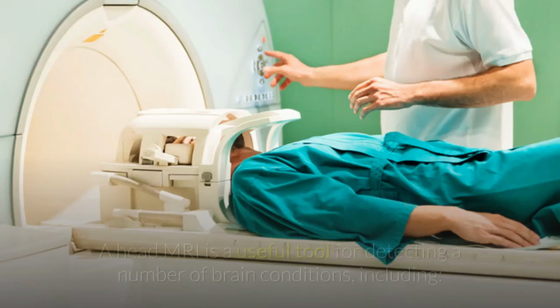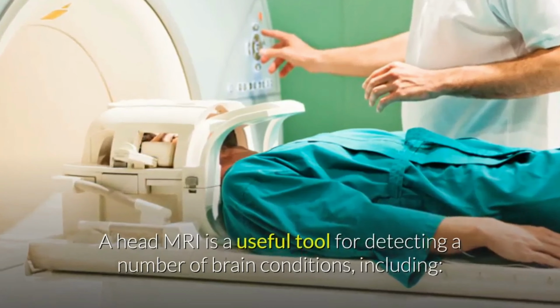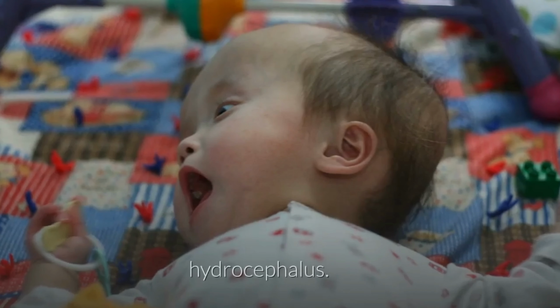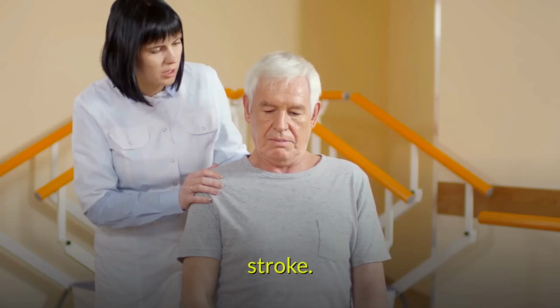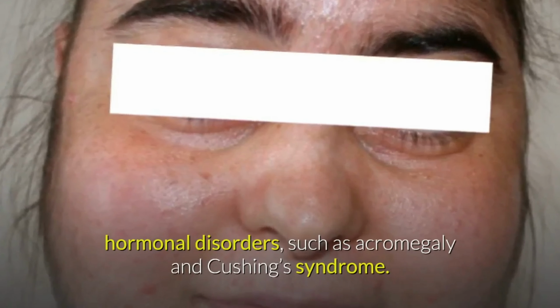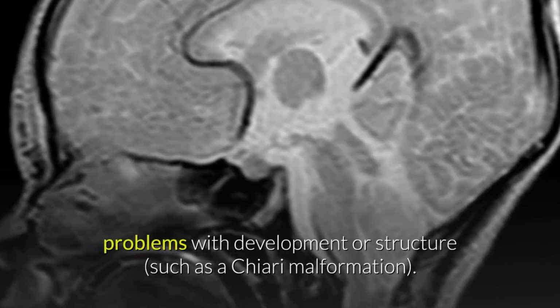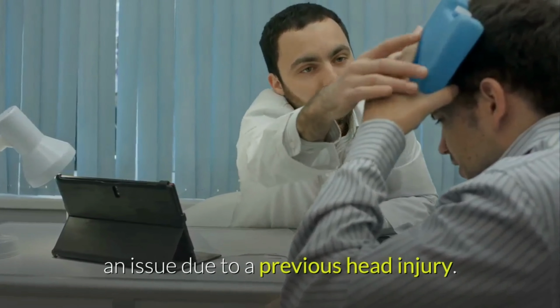abnormalities. A head MRI is a useful tool for detecting a number of brain conditions, including aneurysms, or bulging in the blood vessels of the brain, multiple sclerosis, spinal cord injuries, hydrocephalus, a buildup of spinal fluid in the brain cavities, stroke, tumors, cysts, swelling, hormonal disorders such as acromegaly and Cushing's syndrome, hemorrhage or bleeding, inflammation, problems with development or structure such as a Chiari malformation, blood vessel issues, an issue due to a previous head injury.